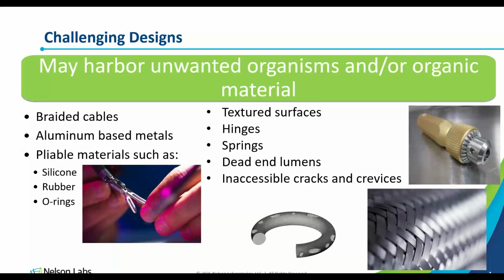Now, it is important to note that there are other documents out there that are meant to monitor things like the water quality used during reprocessing in hospitals. So documents like AAMI ST108, so that's the water quality standard for hospitals and healthcare facilities.